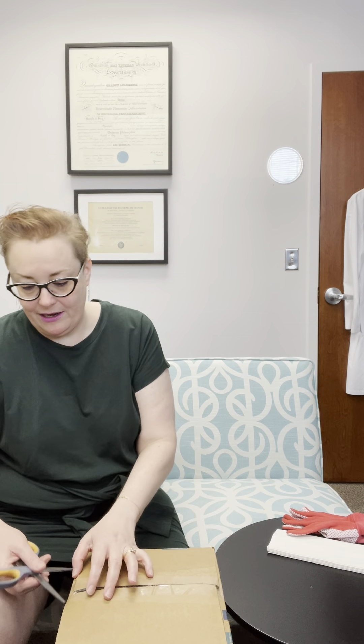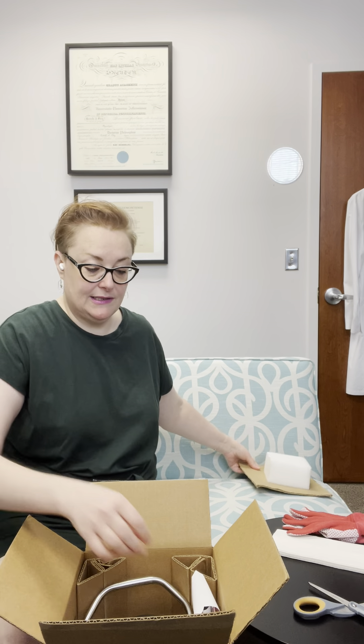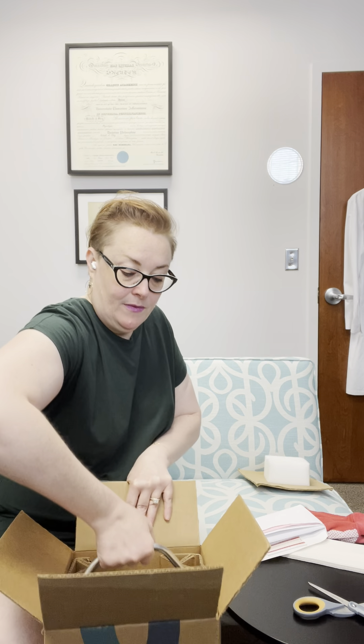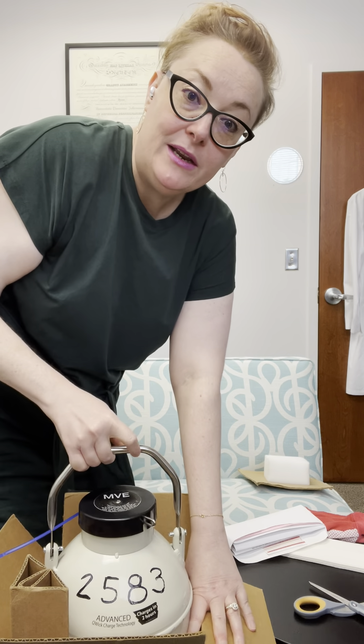So let's see what we have. When you first open the box there's going to be a little plug just keeping everything safe and secure. You can set that to the side, and then there's an envelope with all of your paperwork. You're going to see that the tank is in here. You don't actually have to take it out of the box — you can leave it in — but the tank is in there and it's closed with a zip tie.